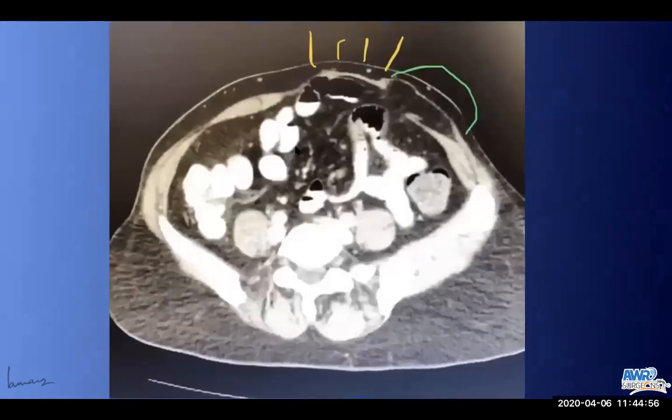Say, for example, in this case of incisional hernia, you can see that the flat muscles have got divided. There is an intact external oblique here. So this is an interparietal hernia, and there is an intact mesh here underneath which there is bowel, and here there is fat. So you have omentum here and you have bowel here on the undersurface of the mesh. So you are pre-warned that this part is going to be difficult, and you should not be too adventurous or careless when you're doing a dissection in this area.